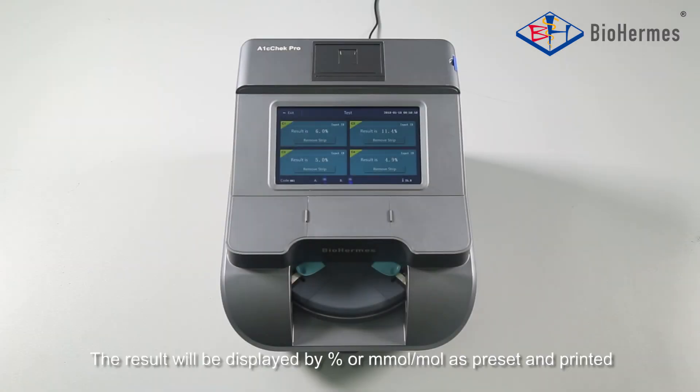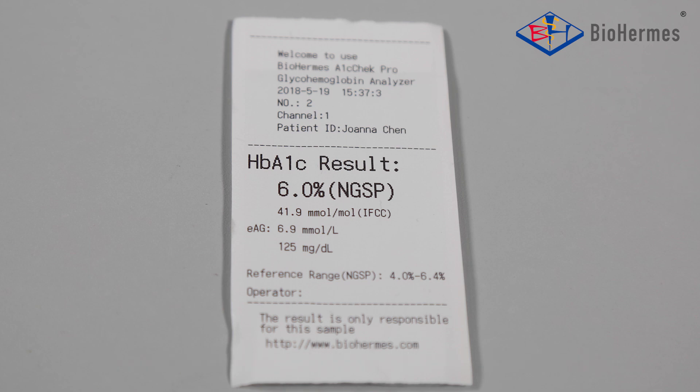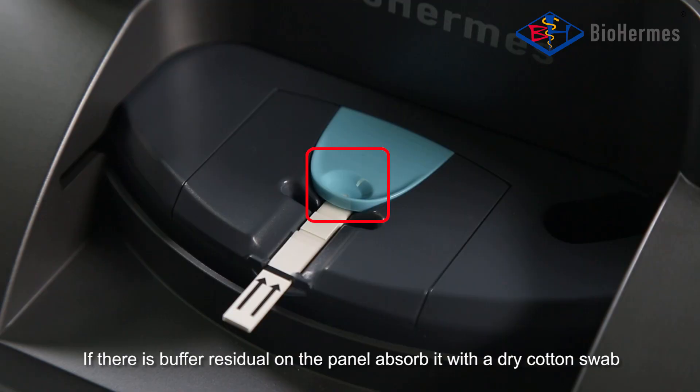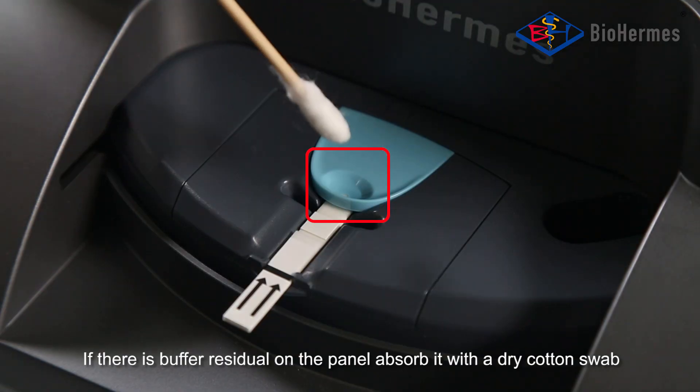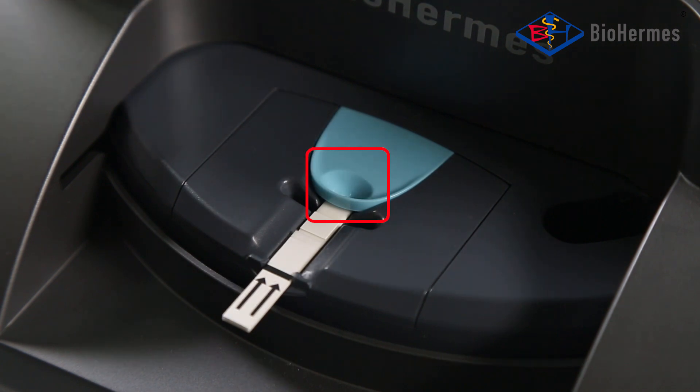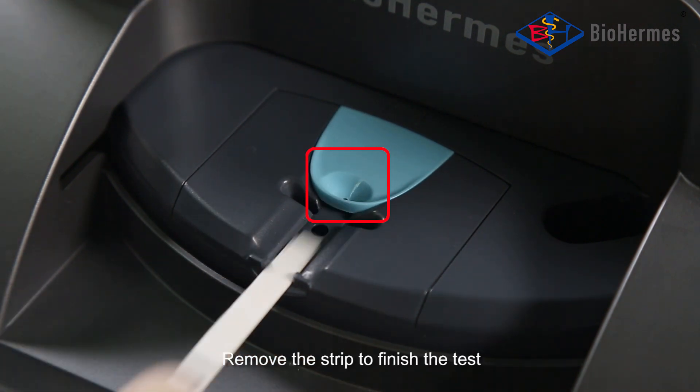Result Reading: The result will be displayed by percent or mmol/mol as per the setting, and printed. If there is buffer residual on the panel, absorb it with a dry cotton swab. Remove the strip to finish the test.